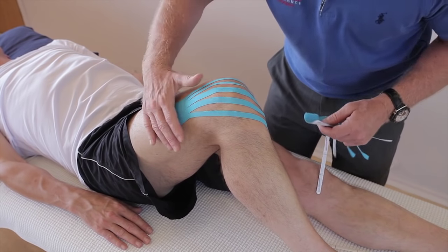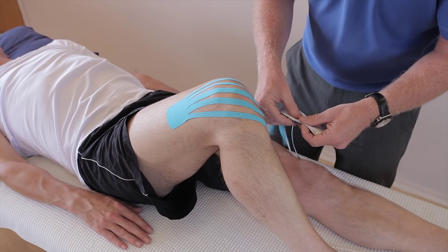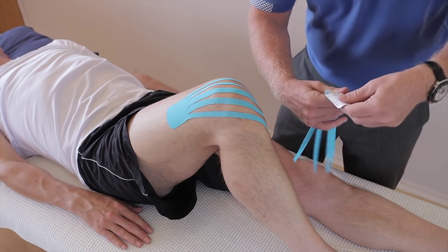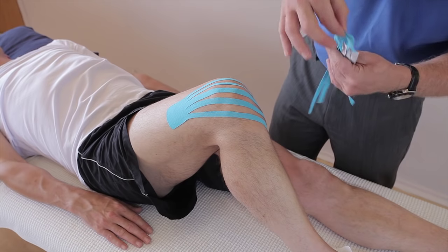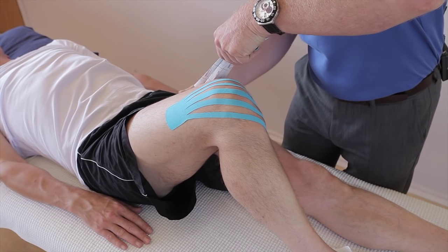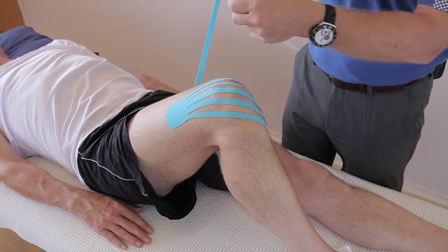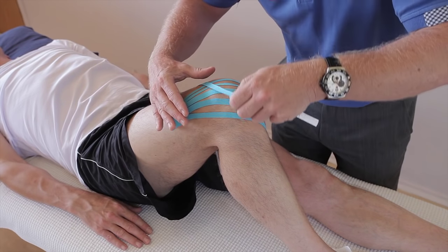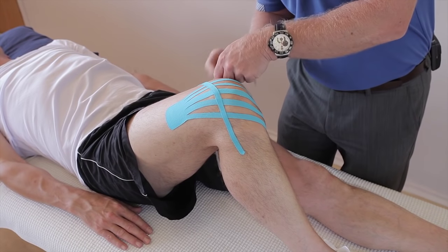The second one is going to go from the lateral side coming to the medial. Now we're going to go from the medial and then finish on the lateral side. Again, break the individual fingers, and then from here apply that on the medial side. The fingers of the second application are going to cross with no stretch the first application.